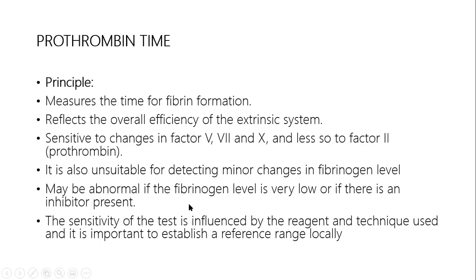Right? So guys, tatlo gali ka scenario, idugang taang abnormal fibrinogen level. Kung ang fibrinogen level sa imo pasyente tam-an kanubo, pwede gali ang iya PT mangin abnormal.